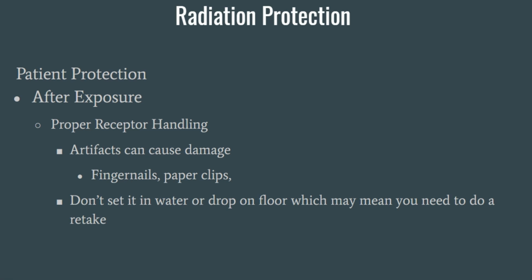And also, again, more geared towards traditional film, don't set it in water or drop it on the floor, which may mean you need to do a retake. Dropping it on the floor, especially if you've already taken it out of the envelope, could cause scratches. Those little microscopic pieces of dust can scratch the film. That's going to require a retake.